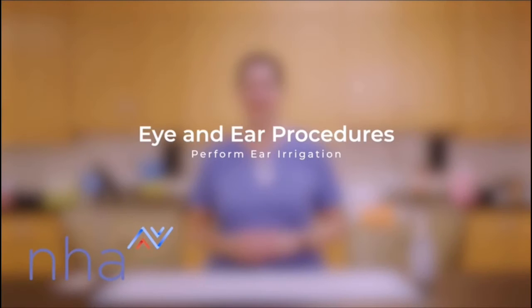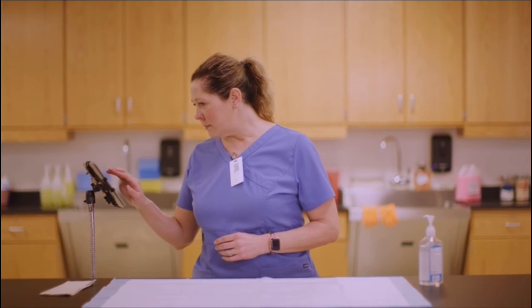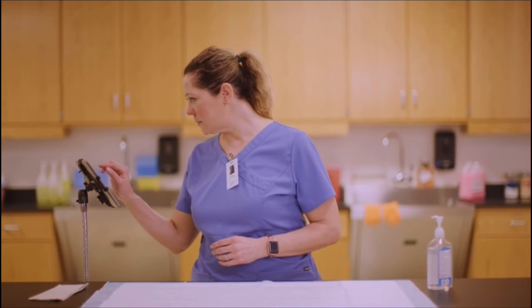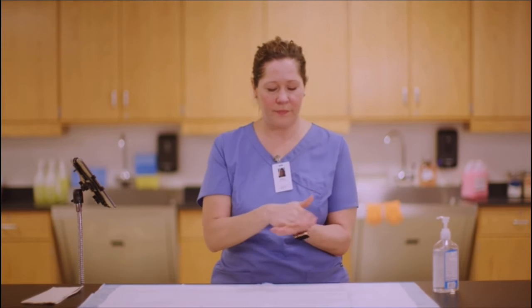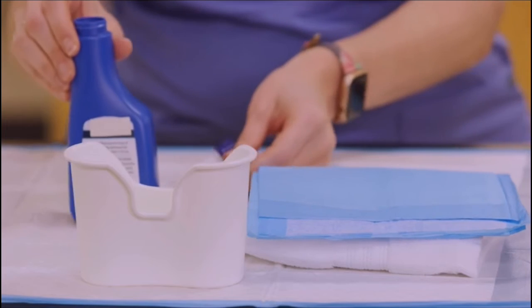Perform ear irrigation. Check the patient's electronic health record to understand the reason for their visit. Take note of the provider's orders. Perform hand hygiene. Assemble equipment and supplies.